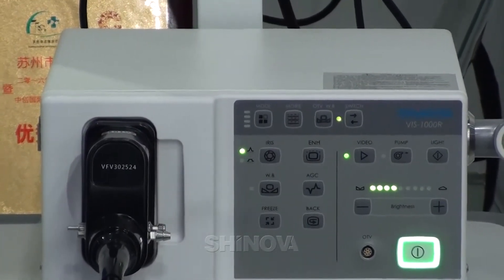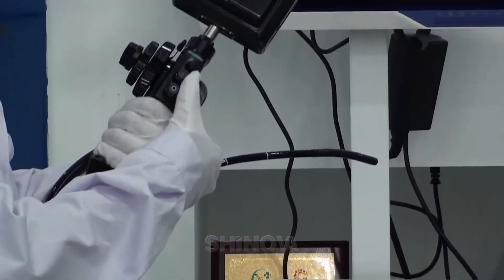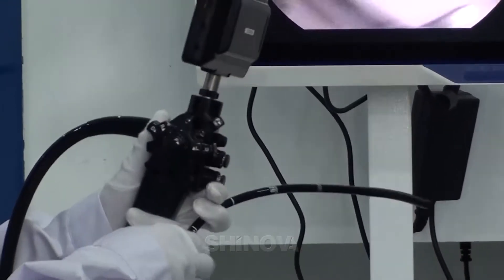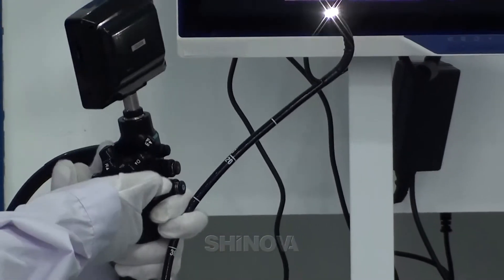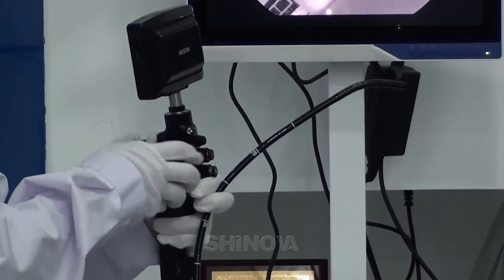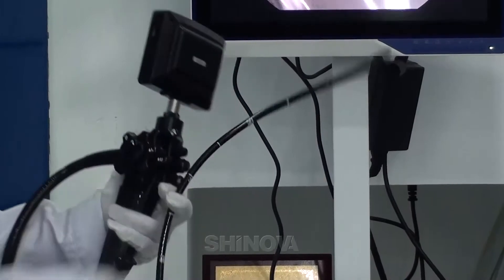Here is the air/water valve. This one is the suction valve. This one is the freeze press. And you can change the deflection direction like this — it's four-way. That's all, thank you.